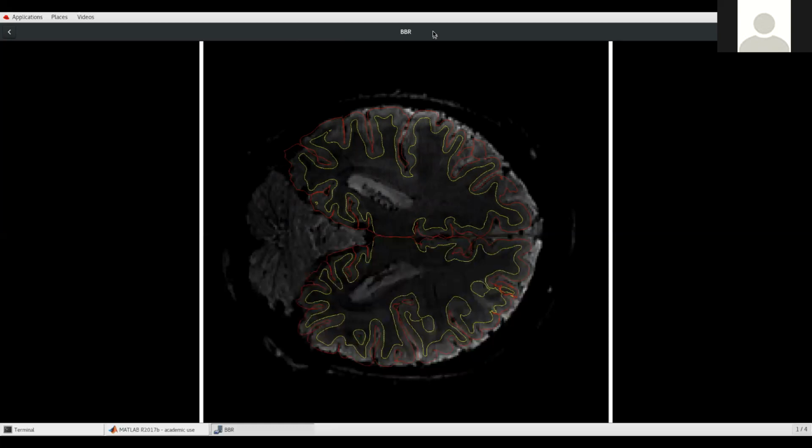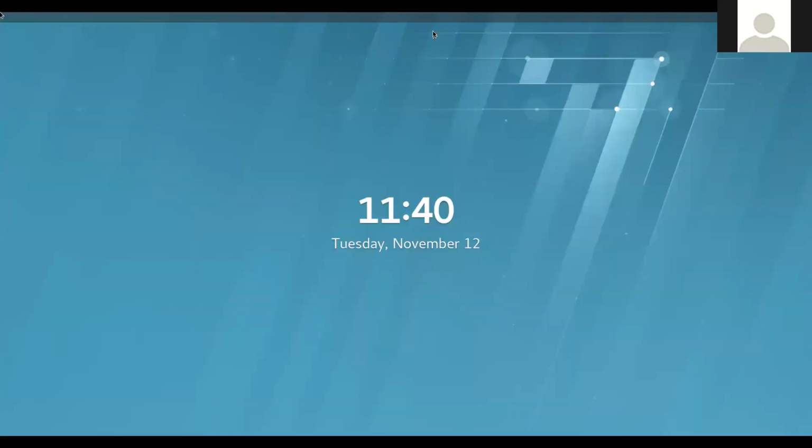Yeah, please, Tyler. Does your method for recursive boundary registration have an option for a mask? Does that basically weight that area as more important for the localized registration? I think at the moment, that mask option is a binary mask for voxels. Yes. So not just more important, just uniquely important.